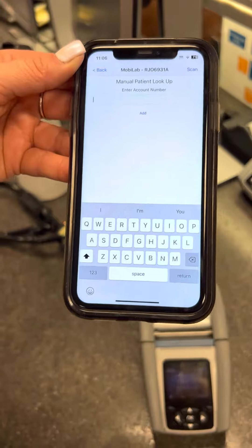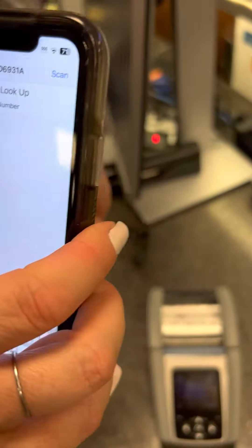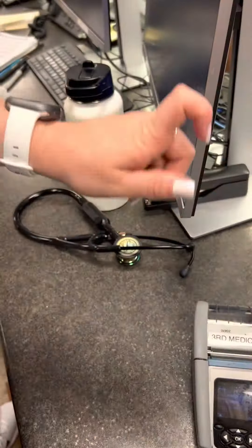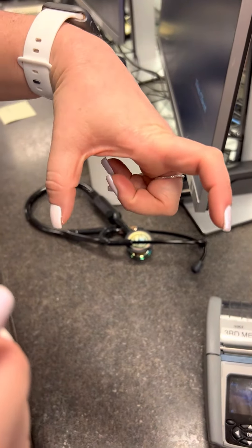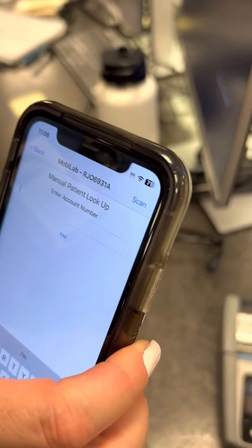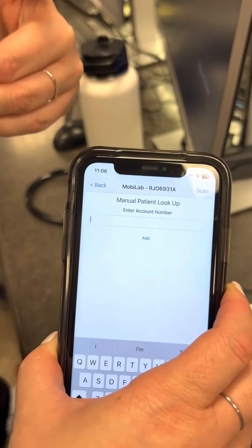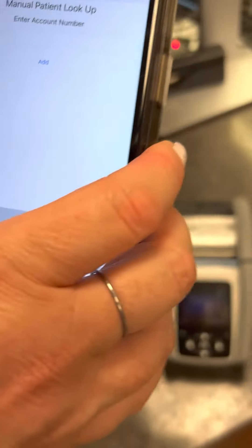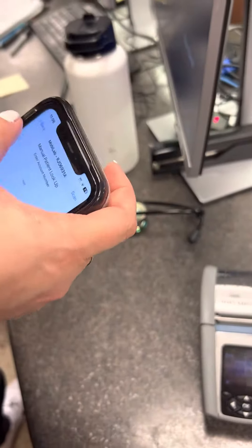At that point you can print it up. You'll scan their wristband, get the sample, scan the sample, and then it'll trigger that the sample has been collected and you're done — and then it will print it.